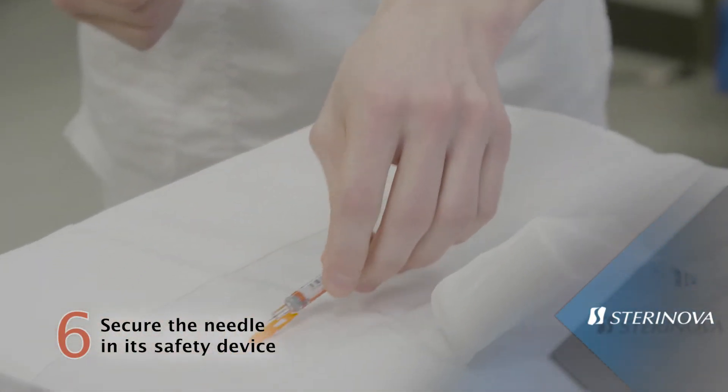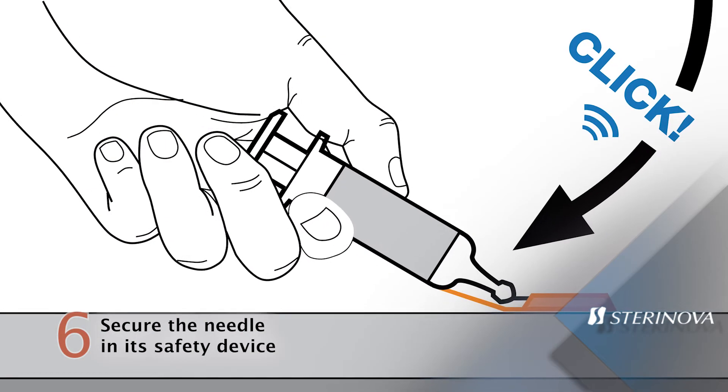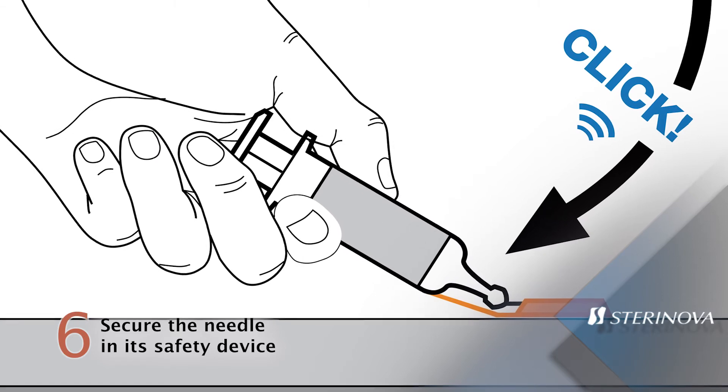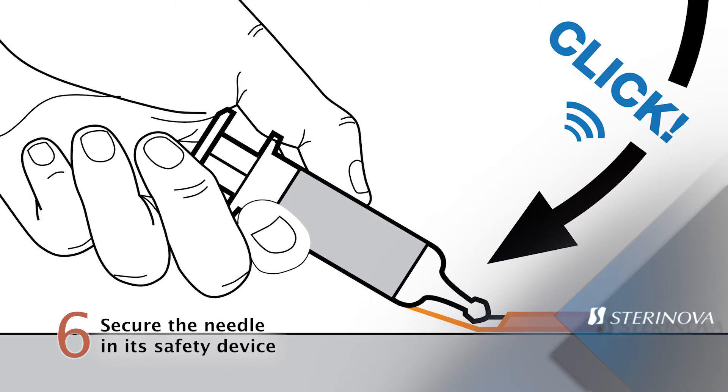To activate the safety device, place it against a hard and stable surface. Hold the syringe with one hand so that the needle enters the safety device. Then press down on the syringe and lock the needle in the safety device until you hear a click.